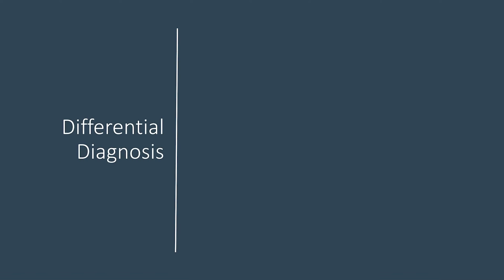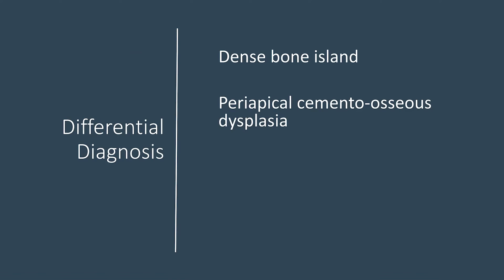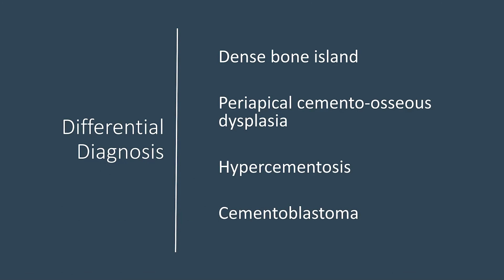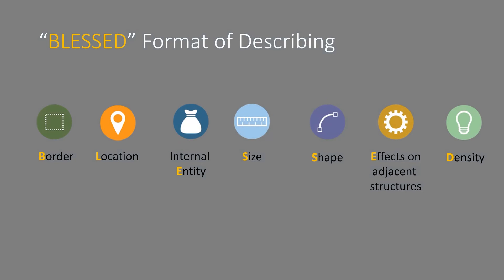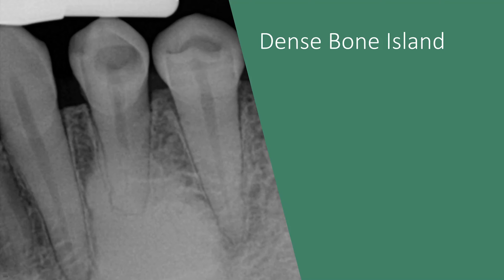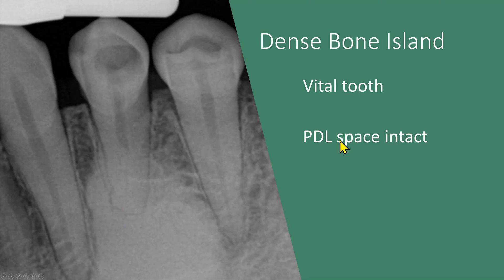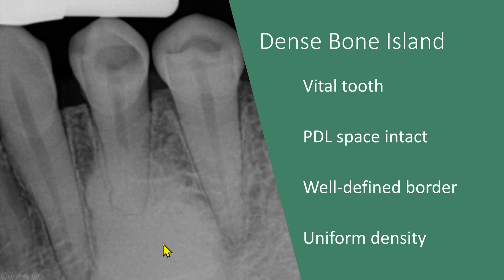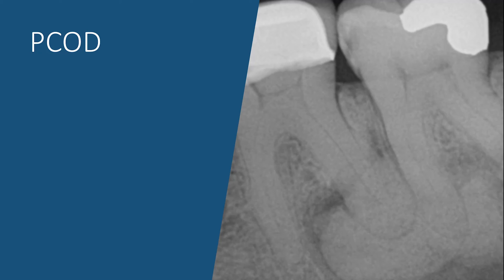The differential diagnosis would include dense bone island, periapical cemento-osseous dysplasia, hypercementosis, and cementoblastoma. Using the BLAST format of description, it is easy to arrive at the correct diagnosis. A dense bone island is associated with a tooth that is vital. The periodontal space of such a tooth is intact, the border is well defined, and the density is uniform or homogeneous. We had discussed this radiograph earlier showing the example of periapical cemento-osseous dysplasia.